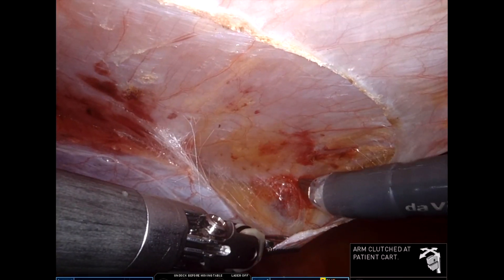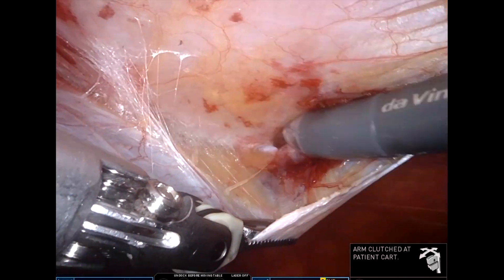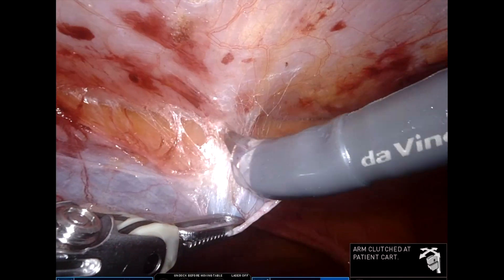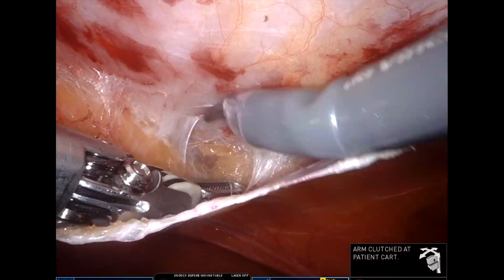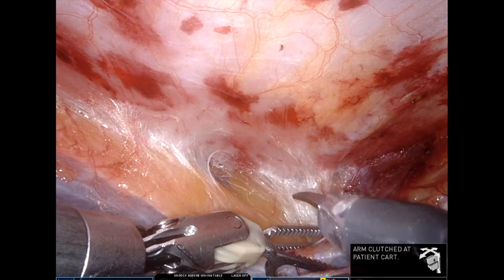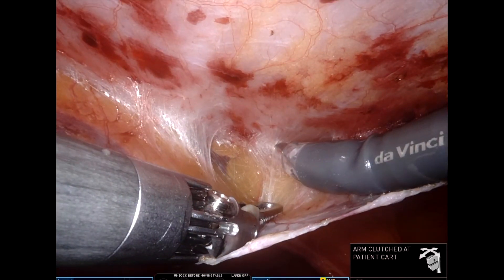When I'm holding it with my left hand, there is no haptic feedback, so you need to be careful that you use your visual cues or visual feedback for this dissection, as it may cause buttonholes if you are not careful enough. Once we start approaching the midline into the pre-peritoneal fatty area, the dissection becomes much easier.